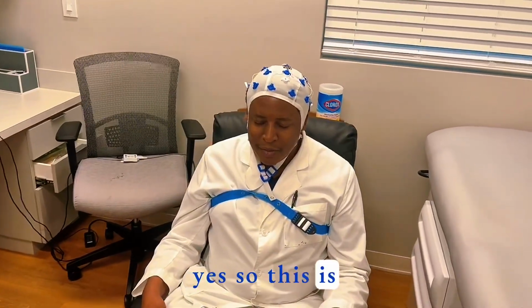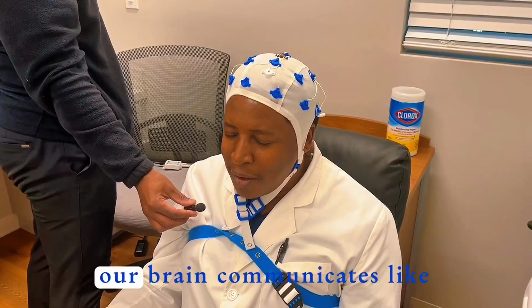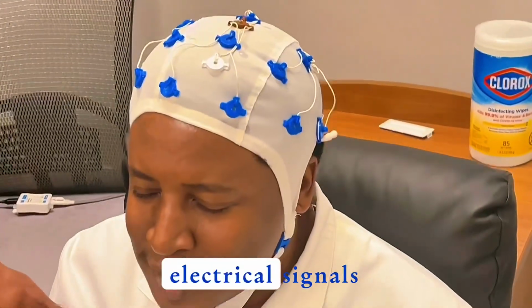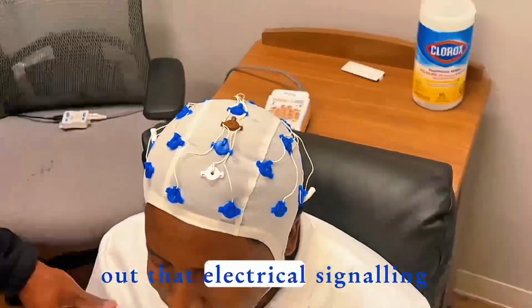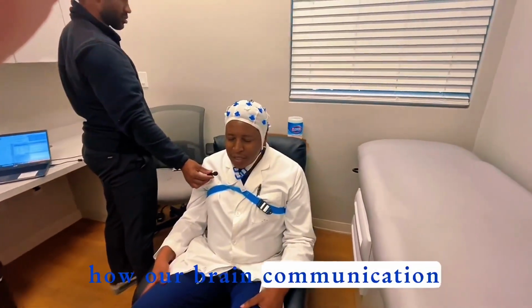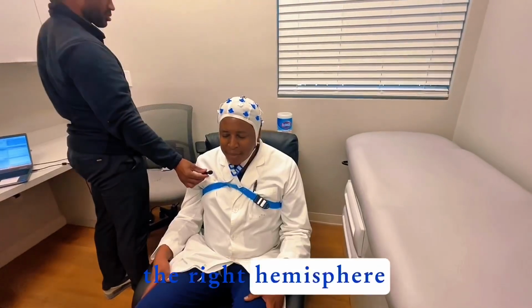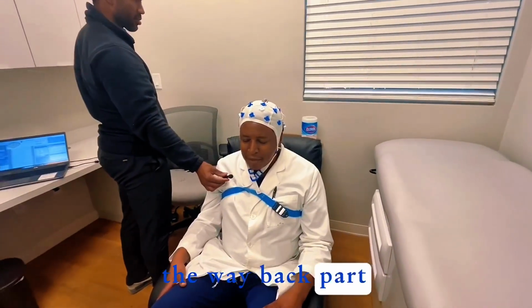Yes. So this is what is called a QEEG. What we're doing is we're getting a map of my brain. Our brain communicates, like all neurons, using electrical signals. Now, a QEEG allows us to map out that electrical signaling and see how brain communication is across the hemispheres, all the way from the left hemisphere to the right hemisphere, from the frontal lobe all the way to the occipital lobe, the way back part of the brain.